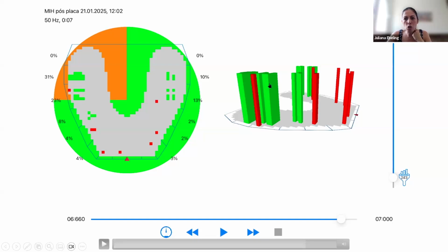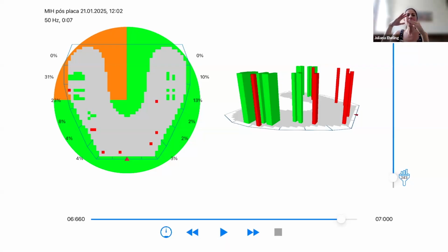So if I want to clear, remember that when I put the sensor between the teeth, what happened? The sensor is flexible. So if I have a patient like this patient with a very detailed anatomic surface of the teeth, this sensor will need to model this anatomy.